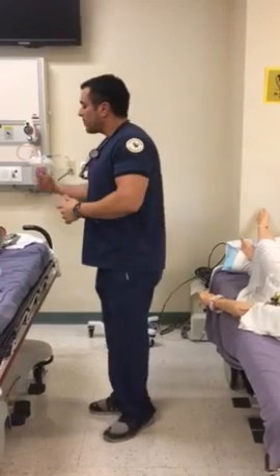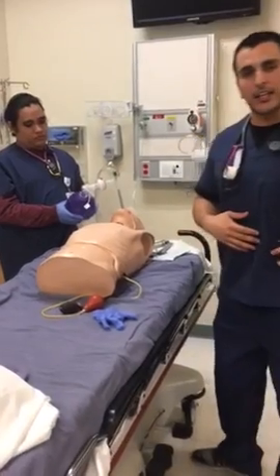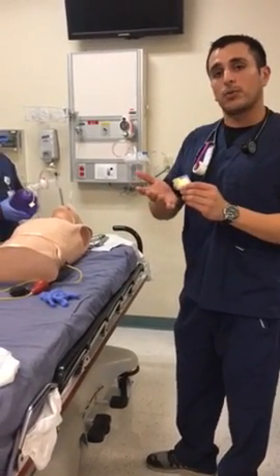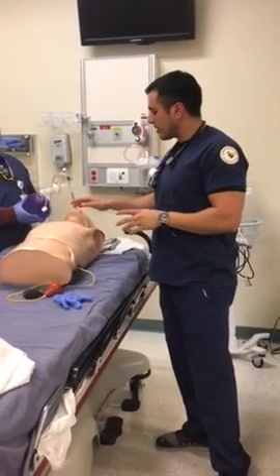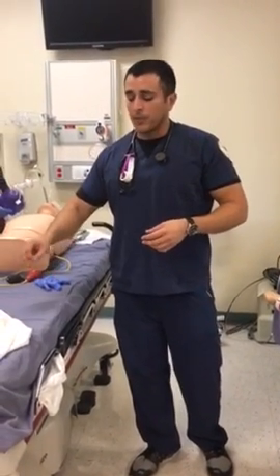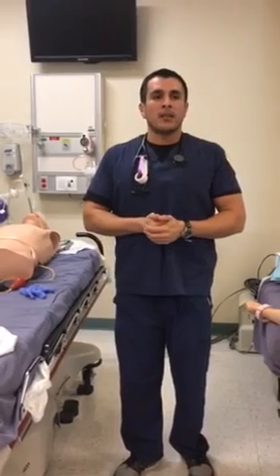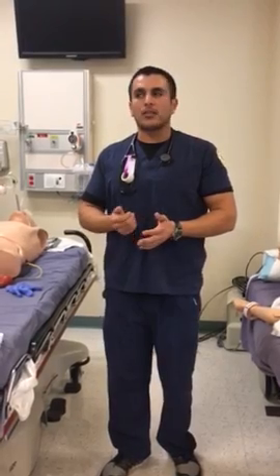If there was an esophageal intubation, one of the ways that you would be able to tell is when you're listening to the stomach, you would hear aeration in the stomach, and also on the capnograph, this might not turn gold because there would be no CO2 return. Also, to tell that you're in the chest, you would see chest rise. You would hear aeration on the left and right. If you heard aeration on the right but not on the left, you might have a right main stem intubation because of the angle of the right stem. So what you would do there is maybe withdraw 2 or 3 centimeters.